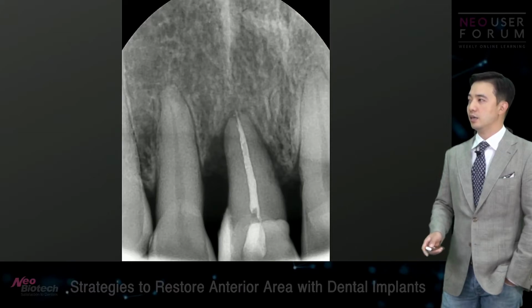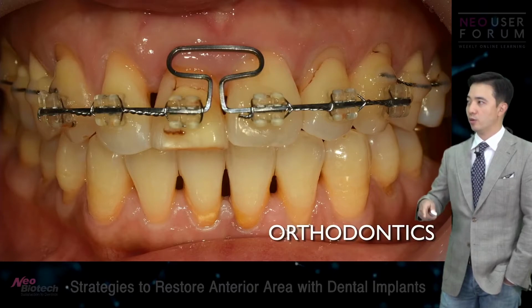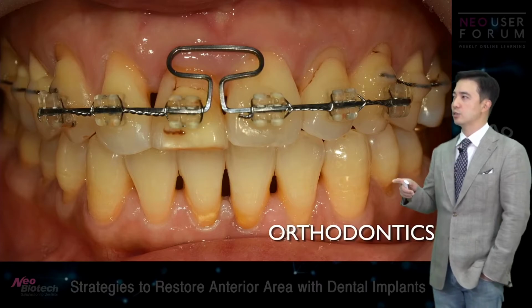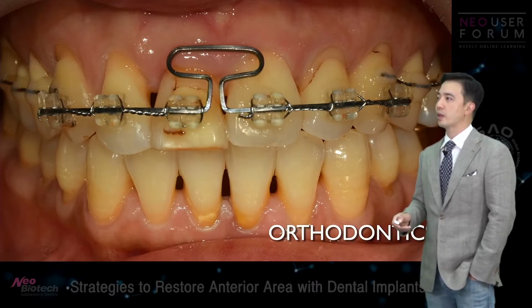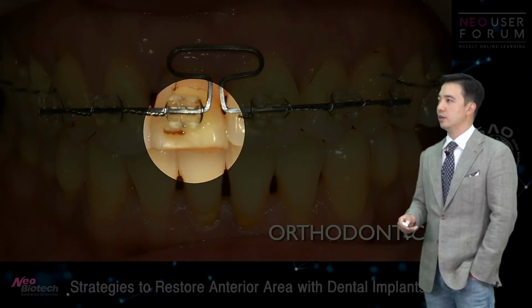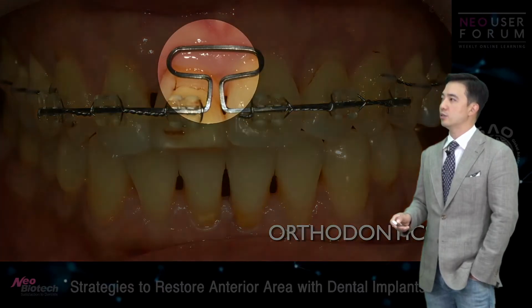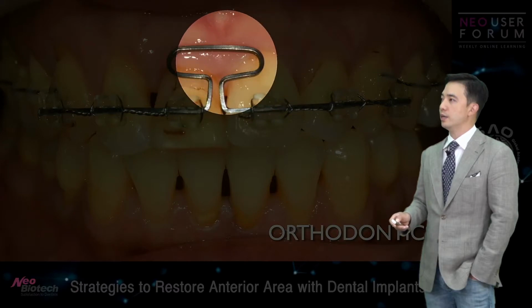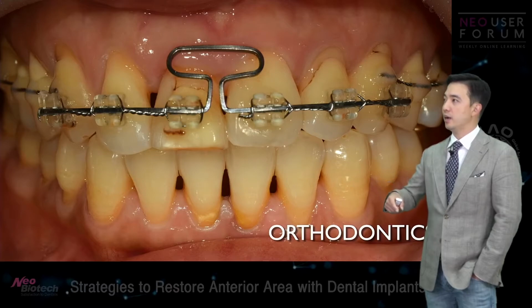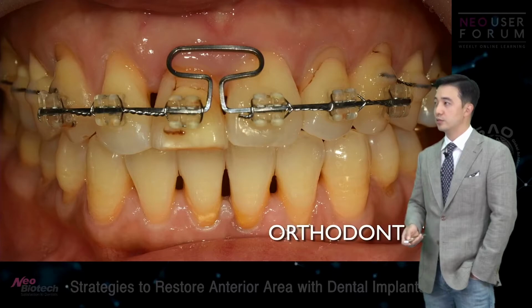So I did endodontics because I was going to do the orthodontic eruption, okay? So as you can see, I kept grinding the crown of number 11, and look at the gingival level of this, okay? Compared to number 21, my number 11 now is apically about 2 millimeters lower than number 21. So this is really favorable, right?